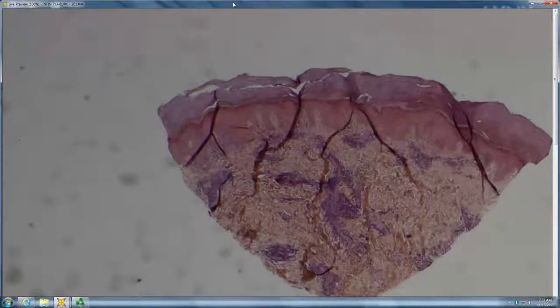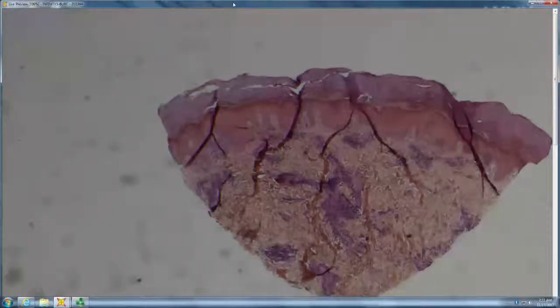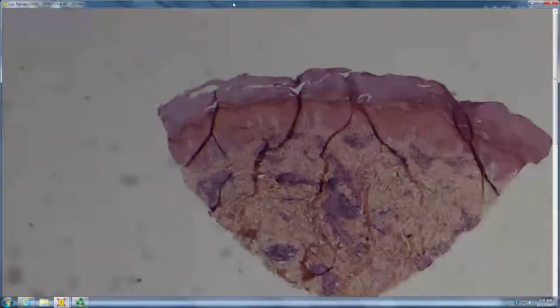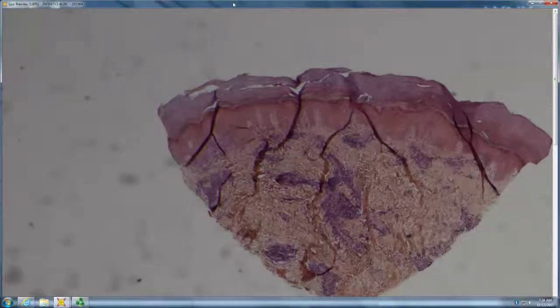So, this is exactly what David just brought up. This one is billed clinically as PMLE, but I'm not sure that you could say this wasn't perniosis. So for this one, you'd have to have a differential. So this is probably the exception that proves the rule. That's as fluffy a PMLE as I've ever seen. It certainly looks just like a perniosis pattern. Apparently, clinically, this patient had polymorphous light. I think this slide easily could represent either one. You'd have to know what the clinical was.